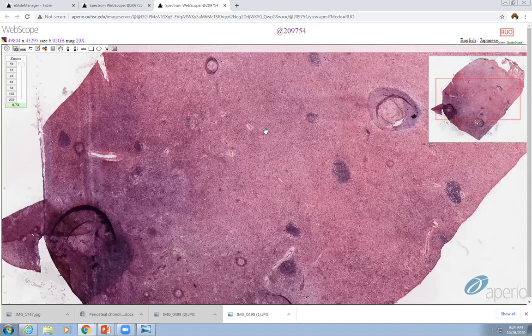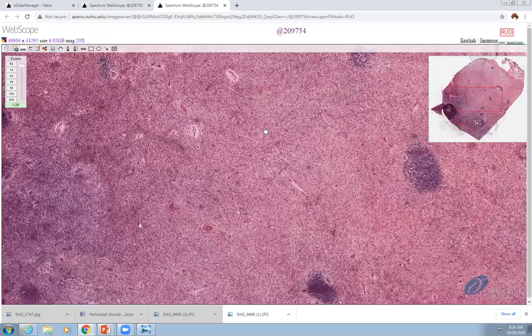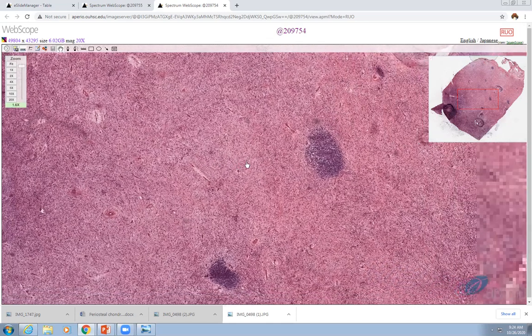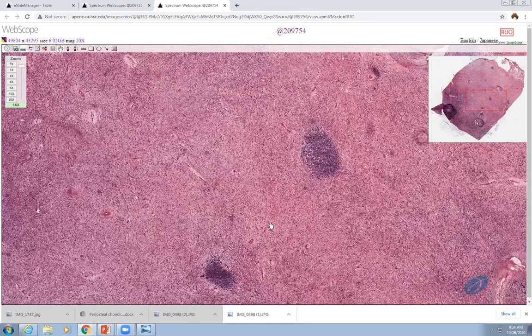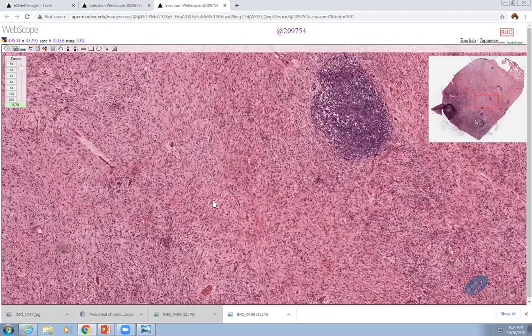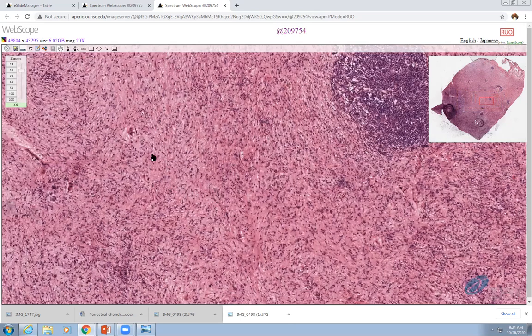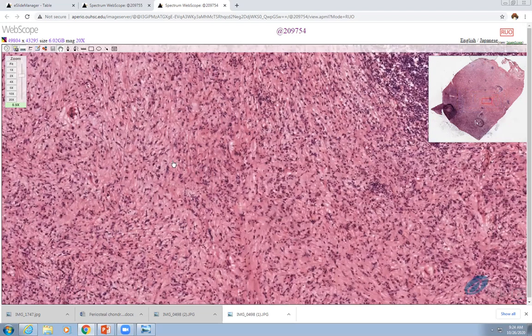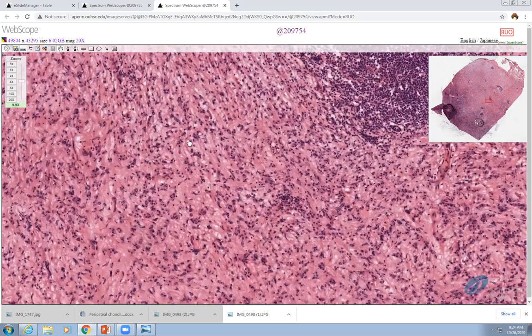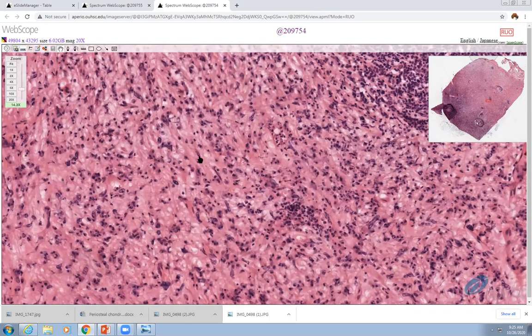At a little higher magnification, we can see that the tumor doesn't have a very prominent vasculature, although there are some medium-sized vessels scattered around. It looks as though we have little clusters and nests of lymphocytes. There is a fair degree of spindle cell type morphology to some of these cells. We see a little bit of streaming but no fascicular growth. There is a fair bit of inflammation associated with this, with some plasma cells and plasmacytoid type cells.